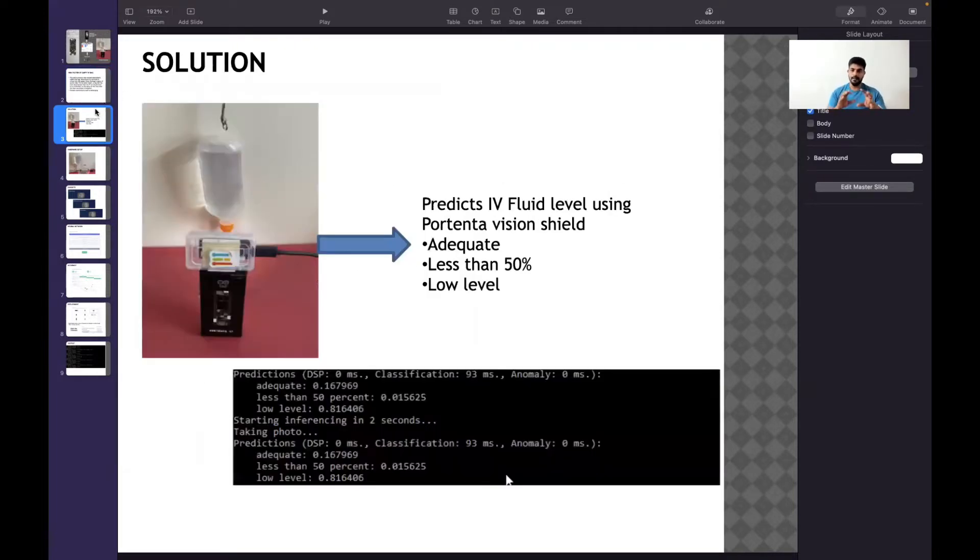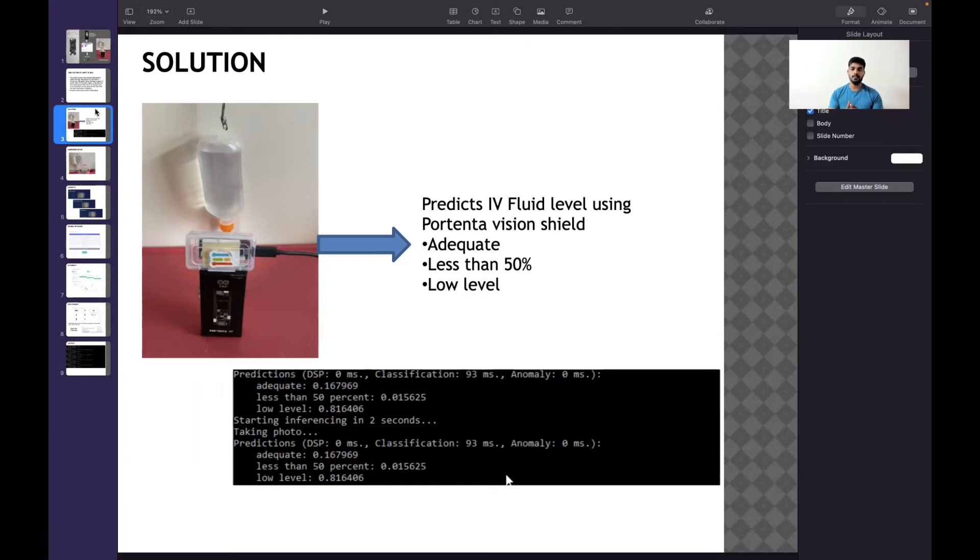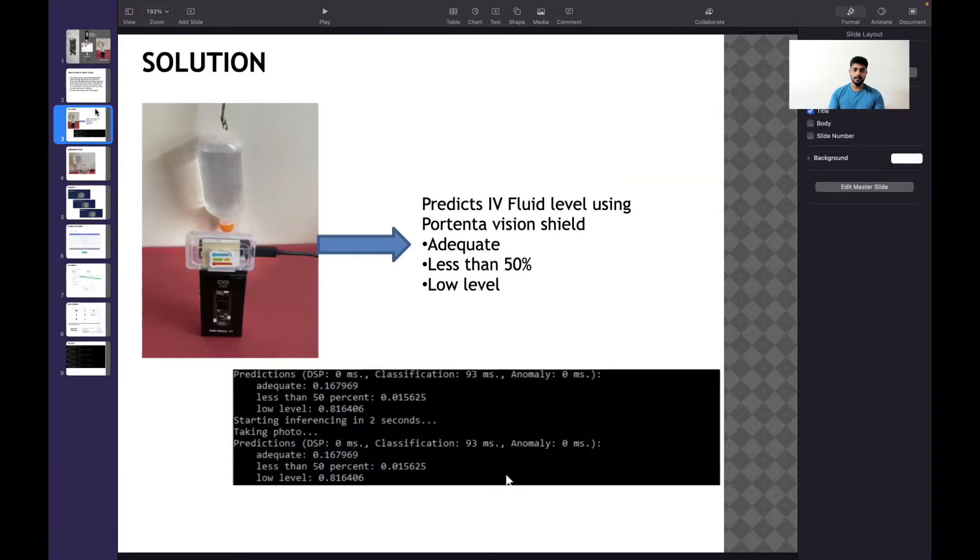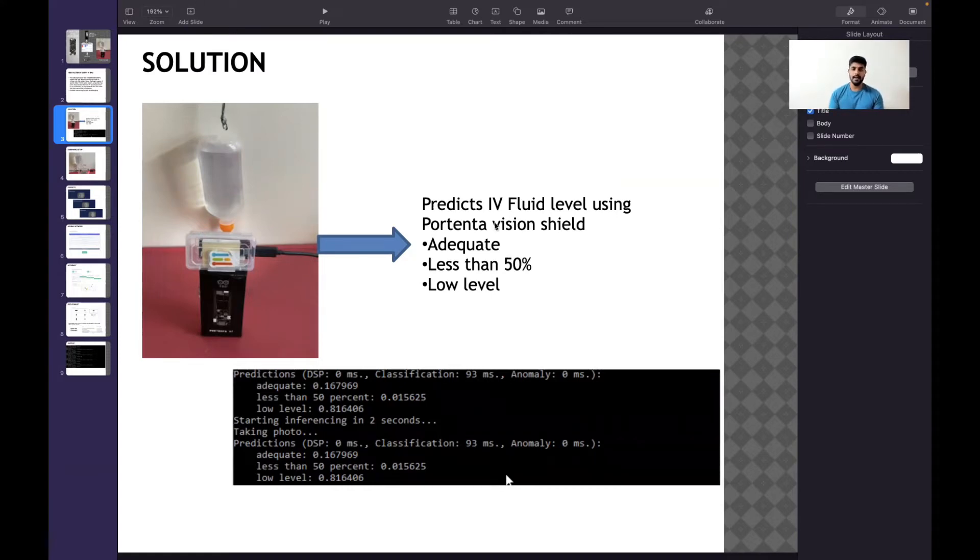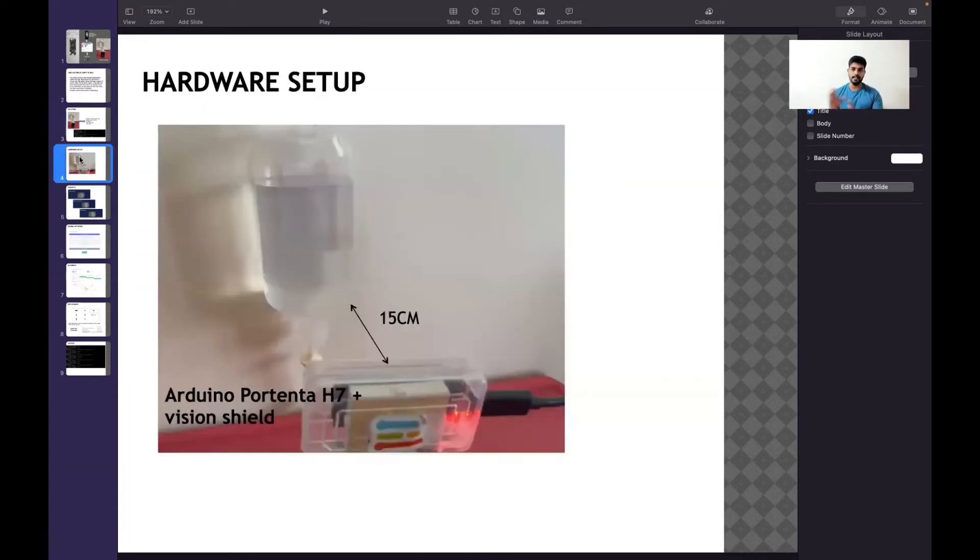The solution is to fit an Arduino Portenta in every IV stand where it can monitor the IV level and send the status to a central monitoring system. We can write application code on top of this model - it can communicate through LoRaWAN or Wi-Fi. Many possibilities are available. In this prototype, I concentrated on the TinyML model, and you can see it will predict whether it's adequate, less than 50 percent, or low level. Let's see the detailed setup, how it functions, and how data acquisition happens.